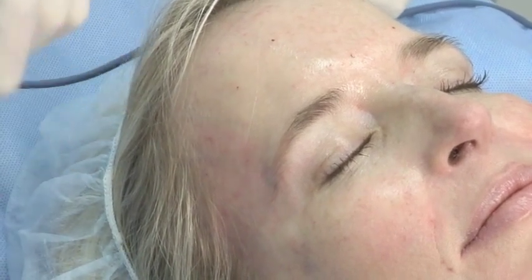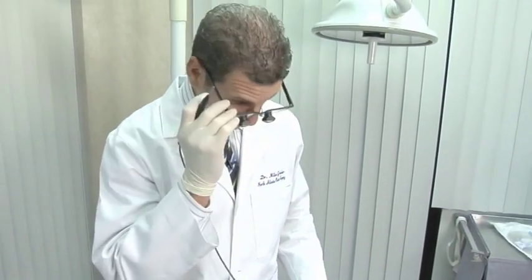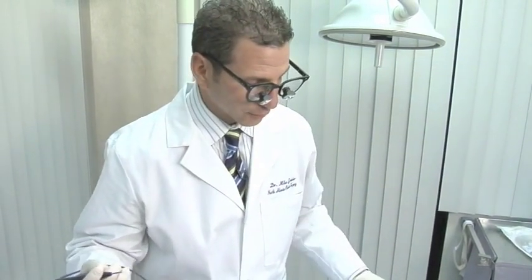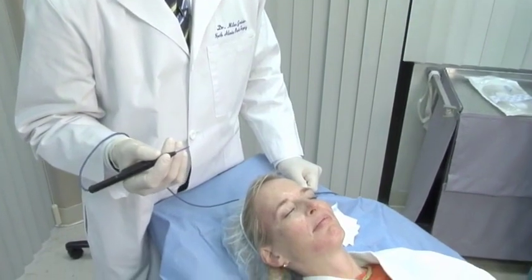You can tap out some that works especially well on the face, but sometimes you can also do them on some little spider veins that are really refractory in other areas, such as the legs. I do think even under the eyelids, you can be very careful and perform this. Some patients are also resistant — if you use a YAG laser, they can be very resistant to it. I found this is a totally relatively painless procedure.